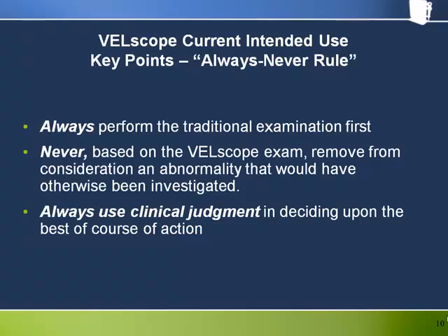Then use the VELscope and never, based on this adjunctive exam, remove from consideration an abnormality that you would have otherwise investigated. If your clinical instincts make you suspicious of a particular area based on the traditional exam, then arguably it doesn't matter how it presents through the VELscope. Remember, clinical judgment is paramount.